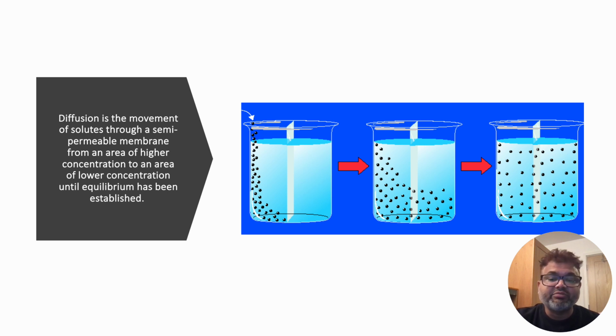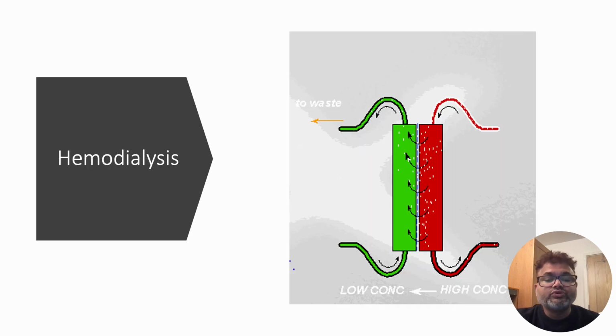And when we say semi-permeable membrane, it's a membrane which allows some of the particles depending on the size and electrical charge, while it stops the other, probably bigger molecules or differently charged molecules. So by this mechanism, most of our hemodialysis machines in the renal unit work.